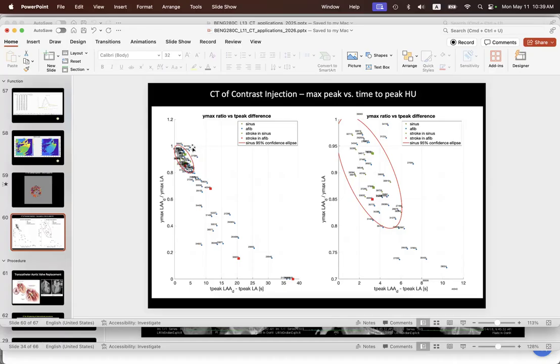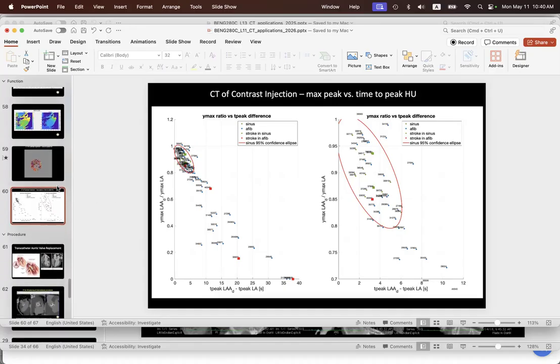So these folks, half of whom in this bundle here are in atrial fibrillation, right? Those folks in atrial fibrillation inside here probably do not need to take a blood thinning drug, because the flow transport is just fine. These folks down here, I don't care what their CHA2DS2-VASc score is. I think you're going to want to put these people on an anticoagulant, just based on the fact that it's so sticky and viscous in their left atrial appendage.